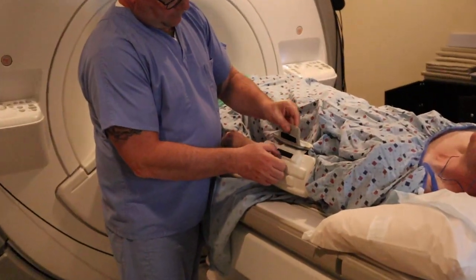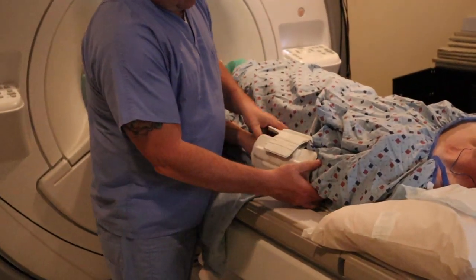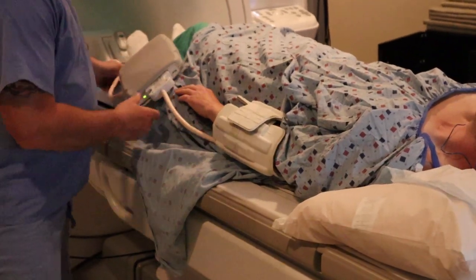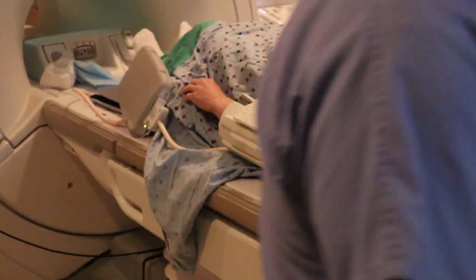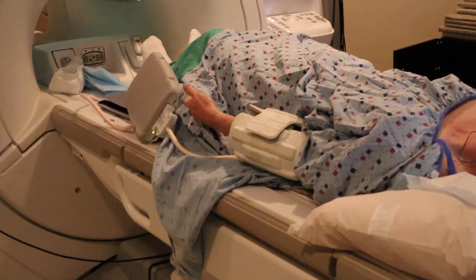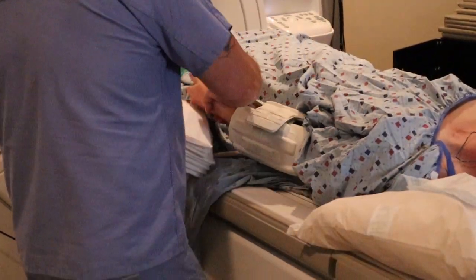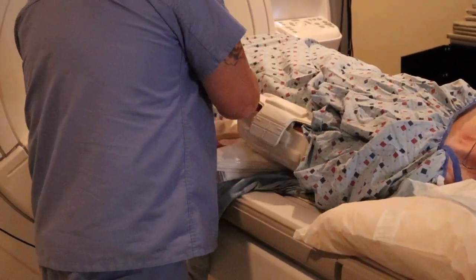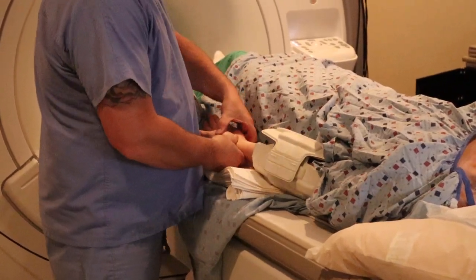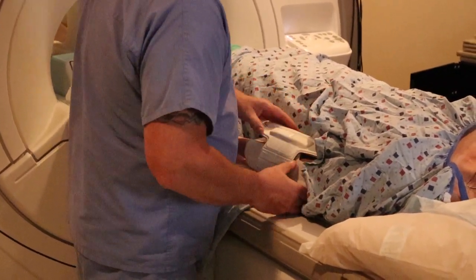Notice the black on black. You want to make sure that the hand is palmer side up — in plane, palmer side up. That allows the elbow joint to open up.